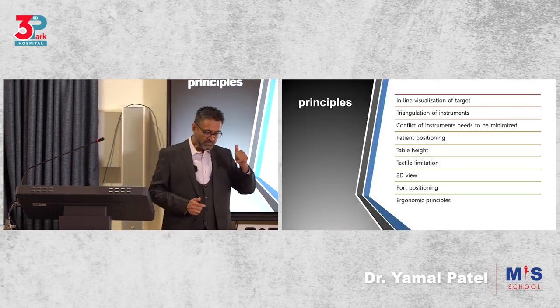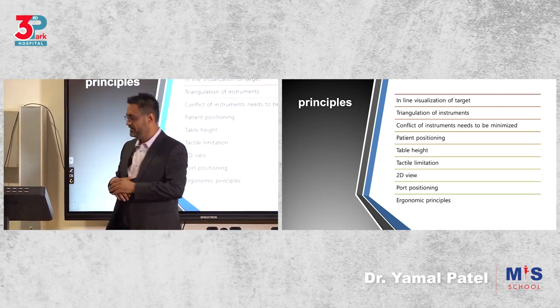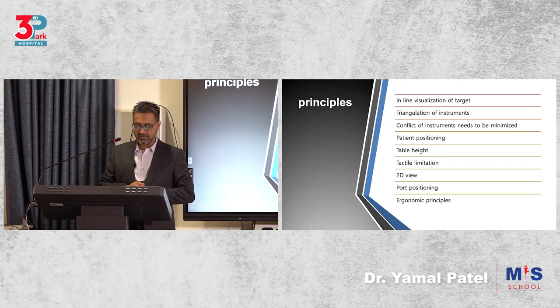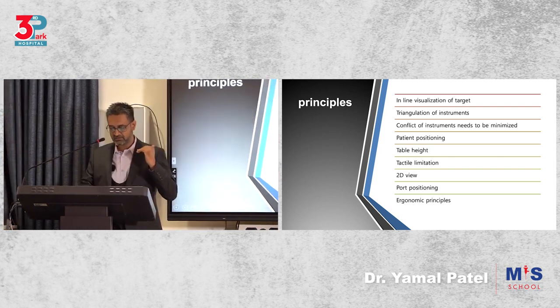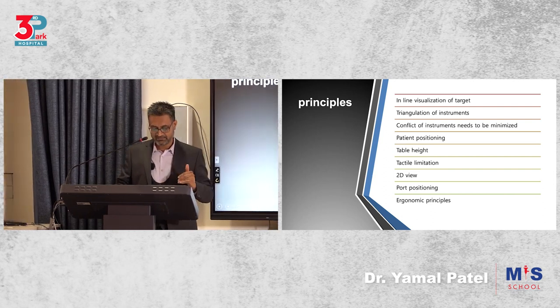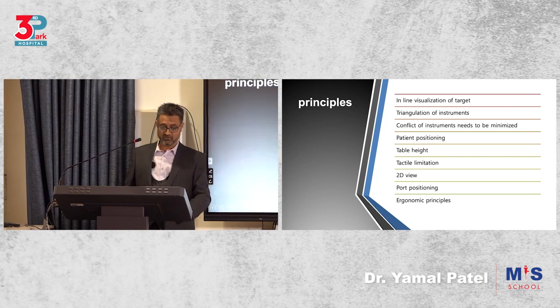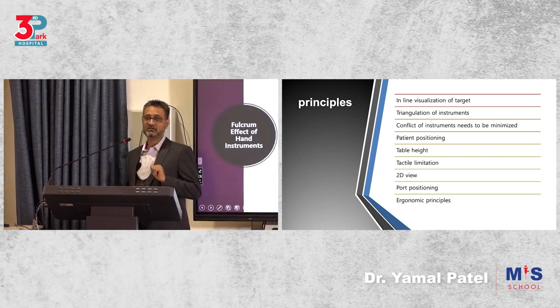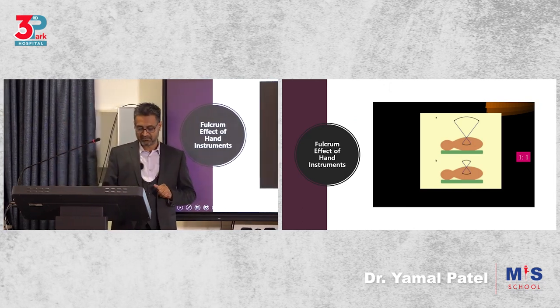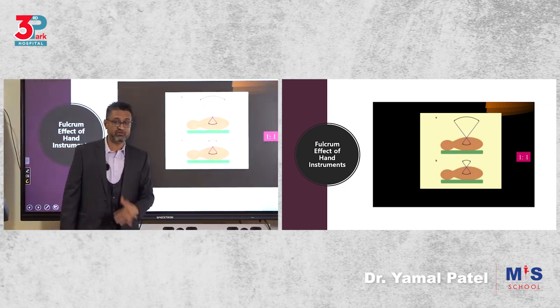Number 1, inline visualization of the target, inline. Okay? Number 2, triangulation of instruments. Number 3, we'll talk about patient position, conflict of instruments to be minimized, table height, tactile limitation, port positioning, ergonomics of instruments, ergonomics of principles of port placement. We need to know the fulcrum effect. We've discussed this. Remember, it's opposite movement, and try and maintain a 1:1 ratio if you can.